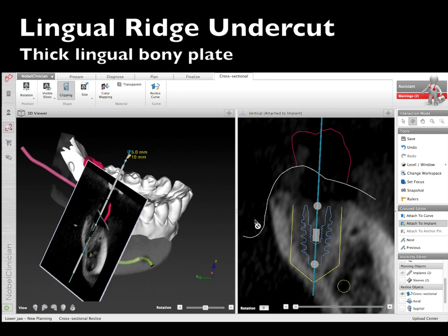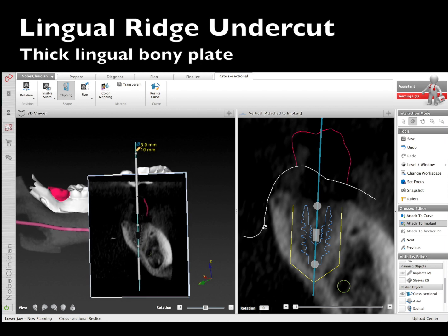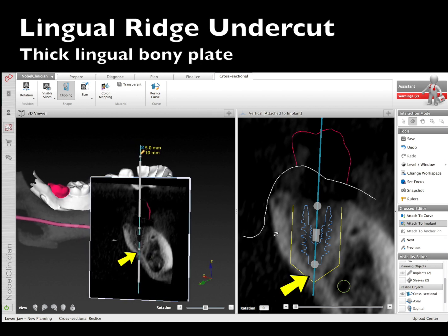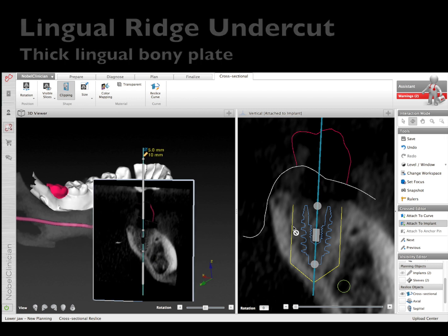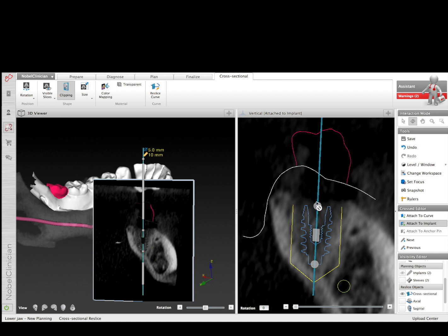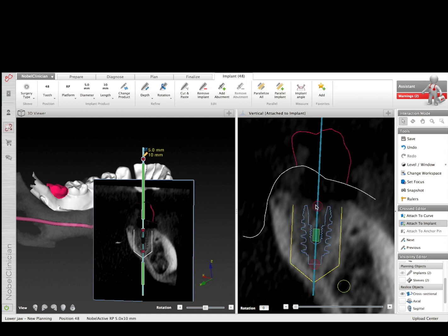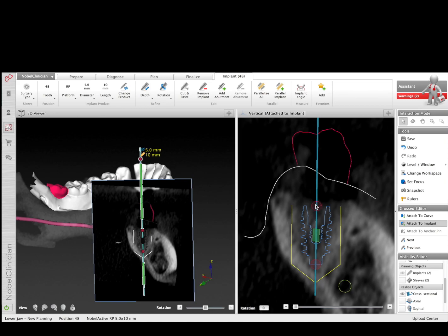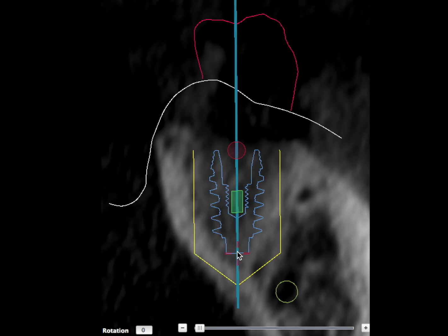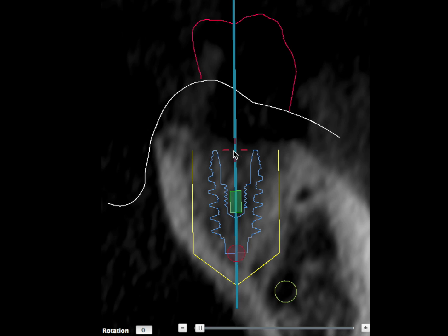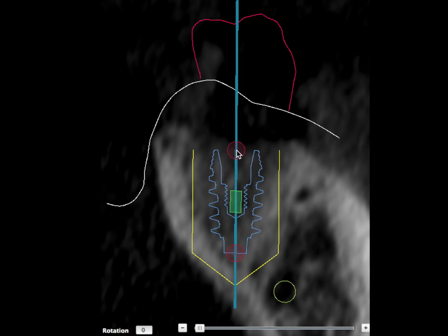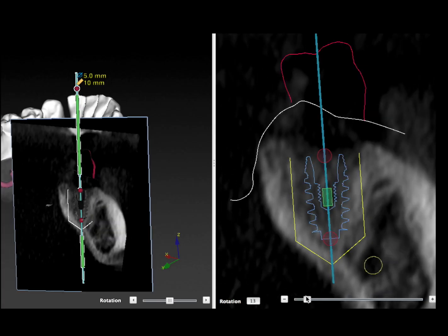We'll place the implant into the bone and have a cross-sectional view by clipping it back. This shows us one of the problems we have to avoid: this ridge undercut. There's a very thick bony plate so we don't want to hit into that thick bony aspect, and we also don't want to drill through this bony plate and perforate underneath the tongue. The software gives us a real good look at what's going on relative to the position of the implant to the tooth, and we can adjust a little bit at the apex to get it coming out through the fossa on the wax-up of the crown.